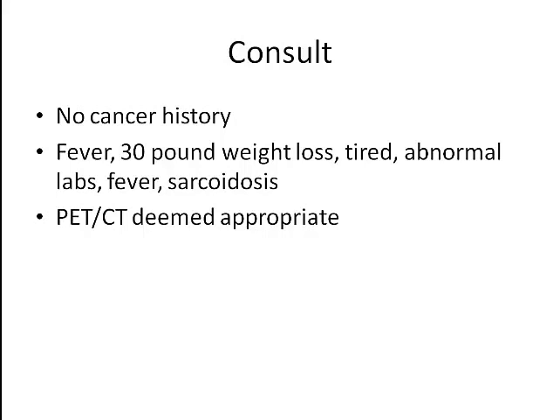So to review, no cancer history, fever, 30-pound weight loss on this patient. And he just kept working and trying to push through, trying to heal himself. He was tired, abnormal labs, fever, and sarcoidosis. Now this was a harder one with the sarcoidosis, because the sarcoidosis on PET, like I said, is false positive. But we did not want to do indium-111 on this patient. We didn't want to end up with SPECT CT of the whole body. We didn't want to do that kind of imaging.